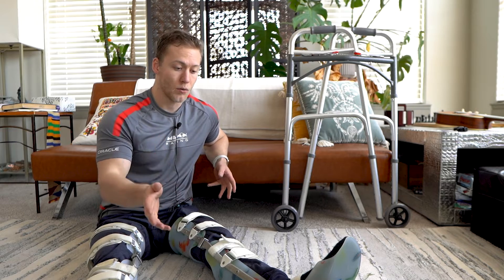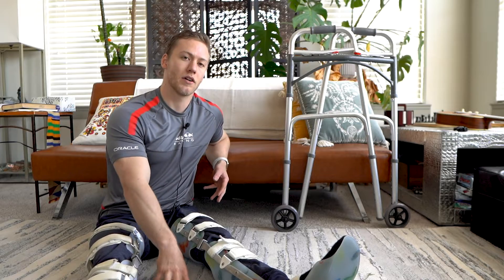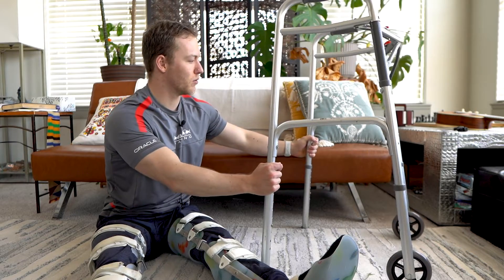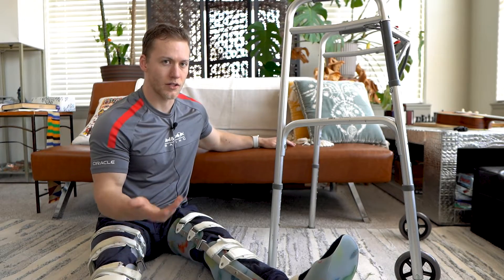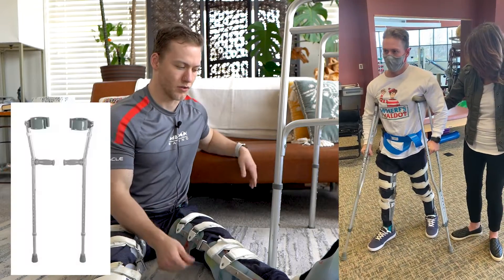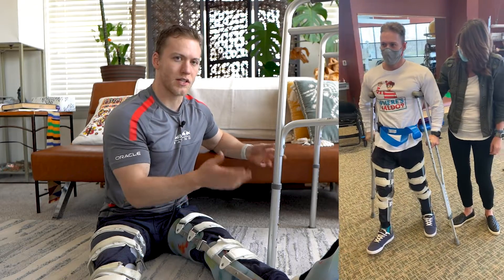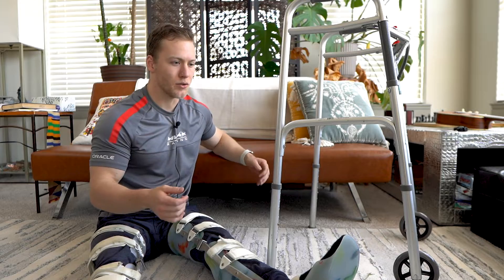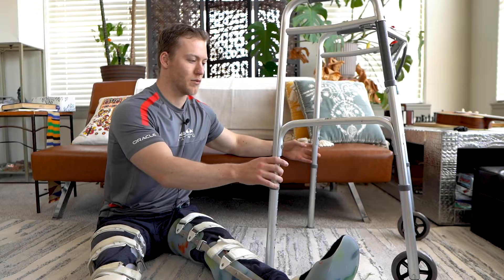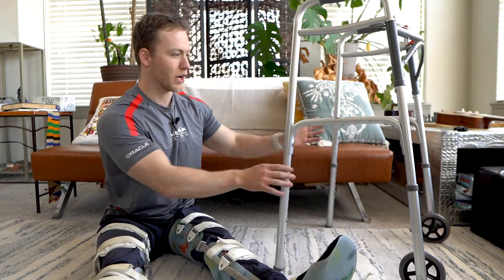If you watched the other video, I said do not put your leg braces on on the ground like I just did, because when we're standing up and walking we're using this walker. There are other things you can use — I've used crutches, forearm crutches, whatever they're called — but this walker from Amazon is pretty cheap and also the safest option. If you begin to fall, it's easier to catch yourself with this, so that's why I choose it.